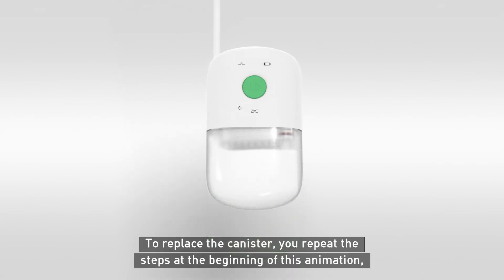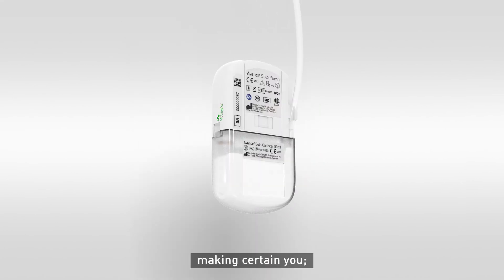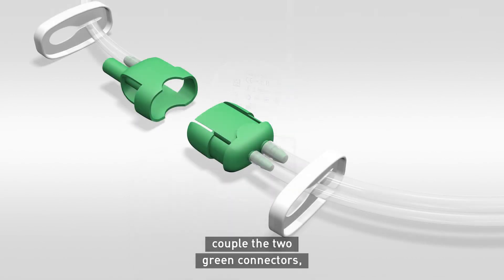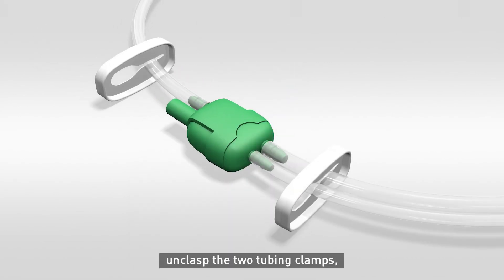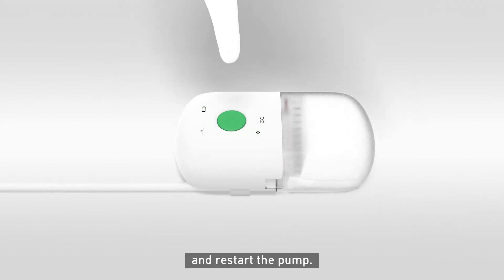To replace the canister, repeat the steps at the beginning of this animation, making sure you secure the tubing in the pinch clamp at the back of the pump, couple the two green connectors, unclasp the two tubing clamps, and restart the pump.